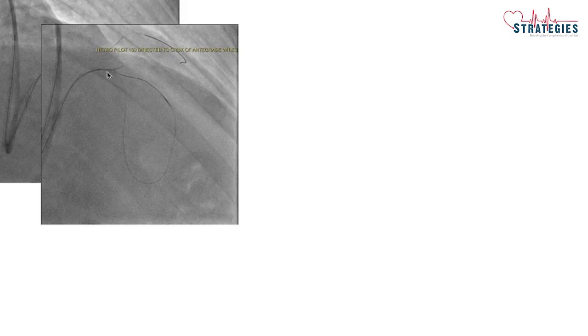So now you have one wire in the septal and another wire in the diagonal. And this crux is basically your LAD. So what I did, I directed my retrograde wire. So I took a Pilot wire.